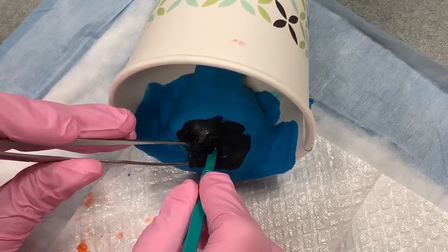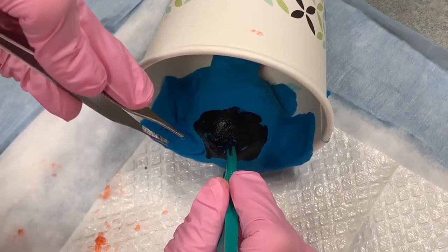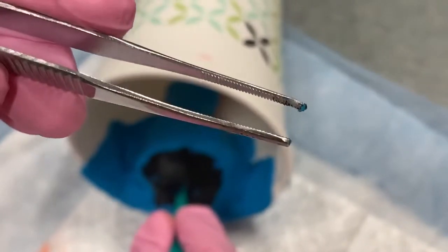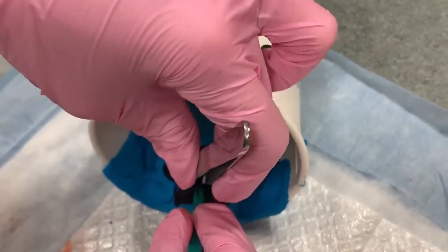Before you take out the scalpel, you will use pickups. These can be toothed pickups or mosquito forceps. And you will grasp the skin and cyst wall before you take out the blade.